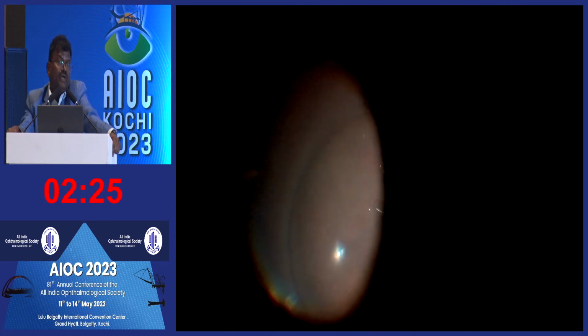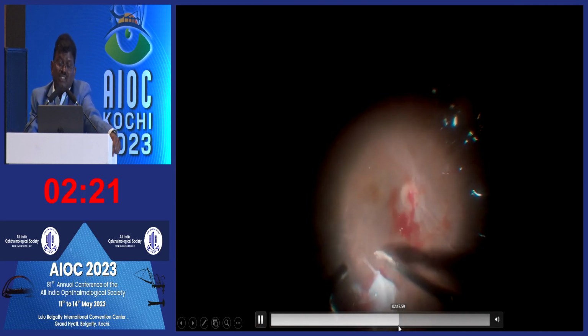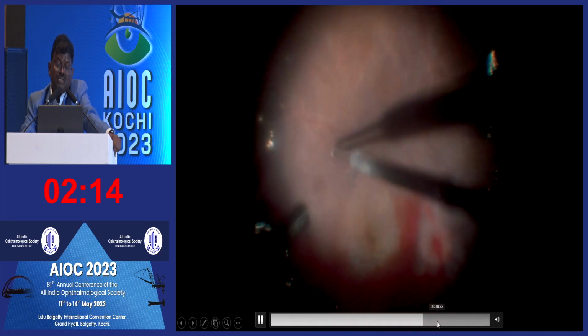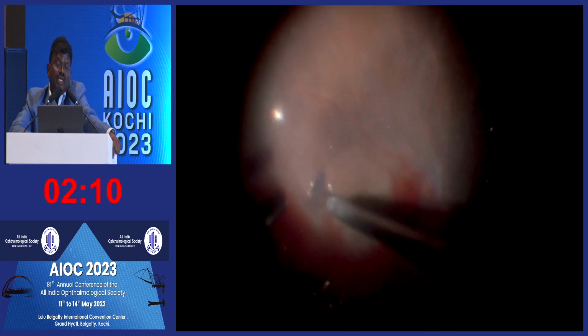without making a retinotomy. So I don't need to do any drainage retinotomy in these cases. Once the retina settles, just remove the preretinal glue. I think it was quite tough, so we have to go again for scissors and the forceps, and peel after staining with the BBG under the PFCL, you peel the membrane.